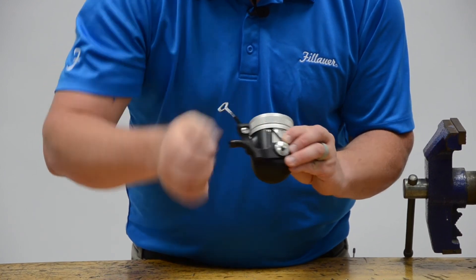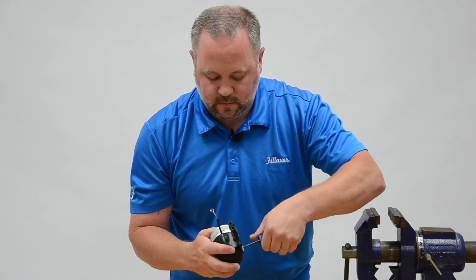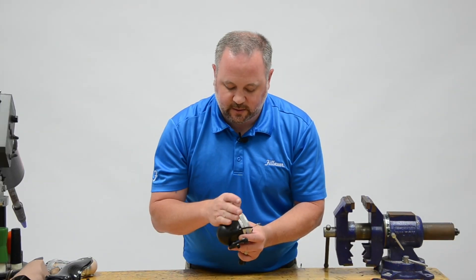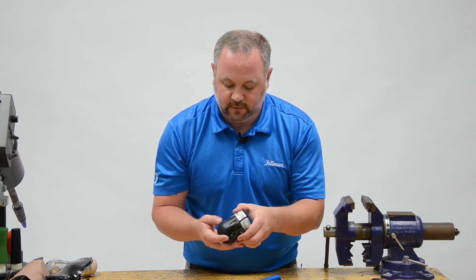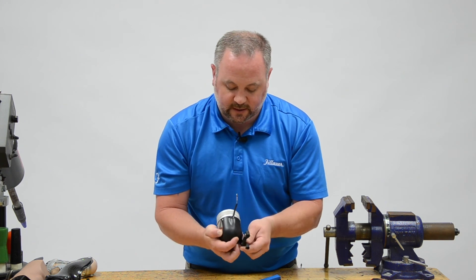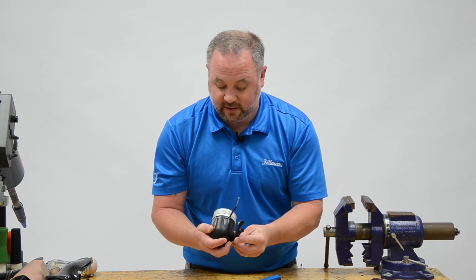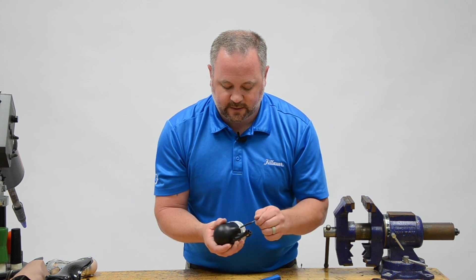We'll go ahead and lock that one in. A great thing to check at this point is to make sure the elbow is going to lock in the correct range of motion. I like to unlock it and check — all the way down is fully extended, all the way up is fully flexed — so I'm unlocking and locking in the correct plane. Go ahead and re-lock that.